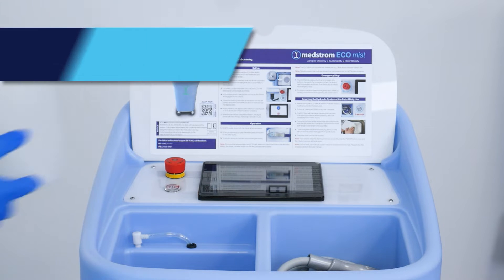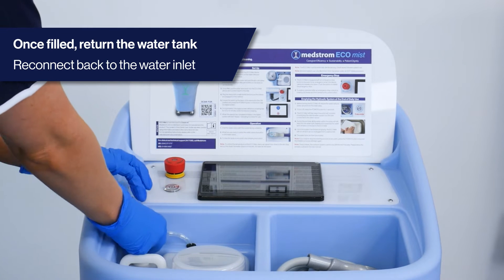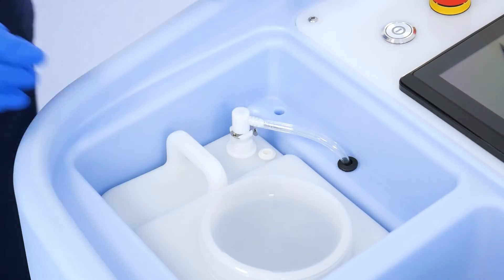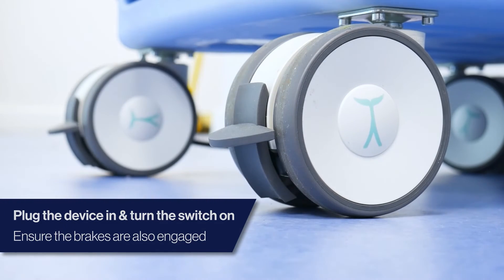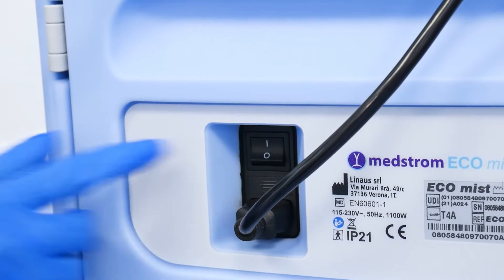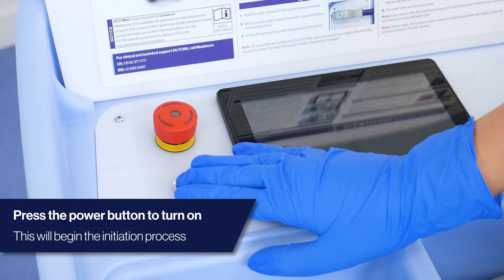Once filled, put the water tank back into the EcoMist device and connect back to the inlet. Plug the device into a wall socket and ensure the brakes are engaged on the casters. Ensure the switch at the back of the device is in the on position and press the power button on the front near the digital screen.